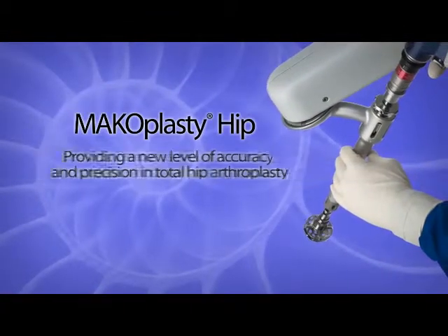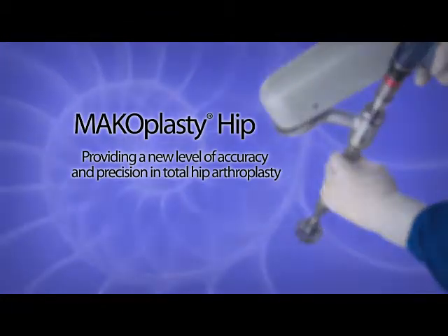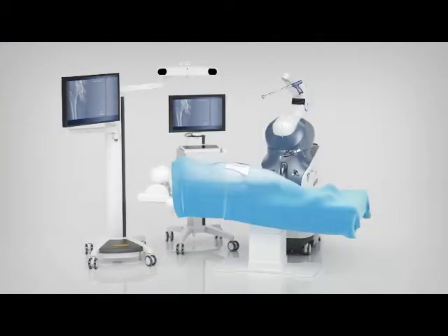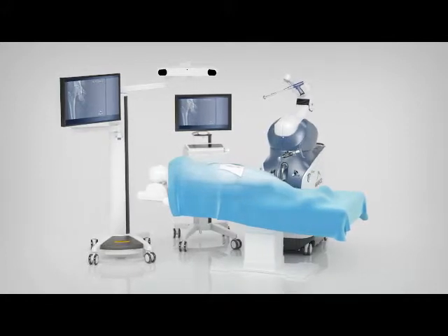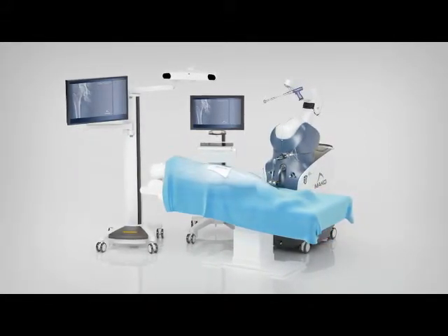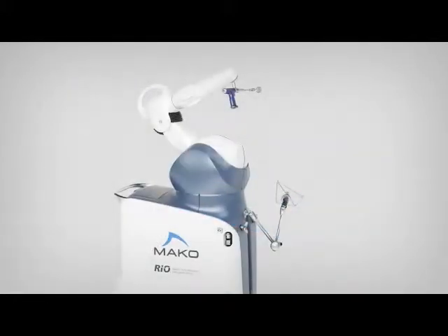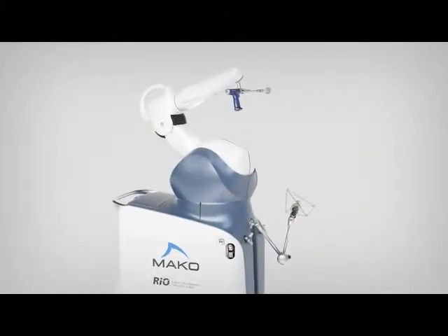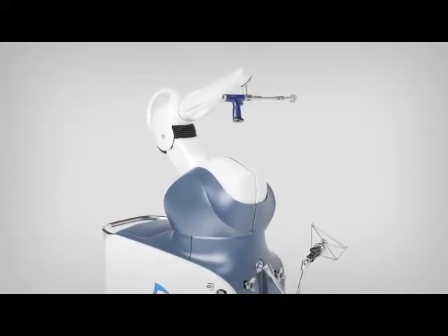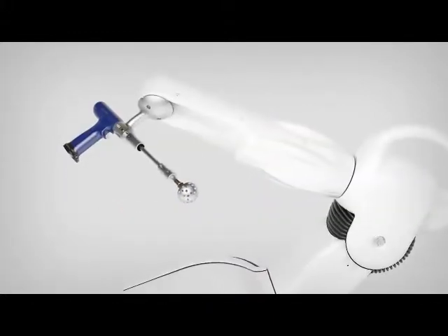Makoplasty Hip, providing a new level of accuracy and precision in total hip arthroplasty with the assistance of innovative robotic arm technology. Rio Robotic Arm Interactive Orthopedic System assists surgeons in achieving a new level of precision and more ideal hip implant positioning.